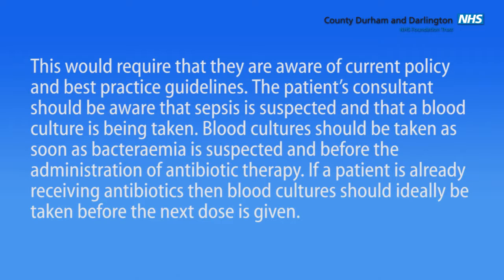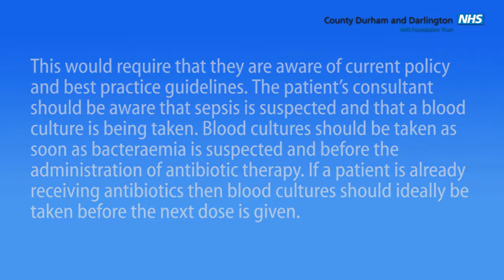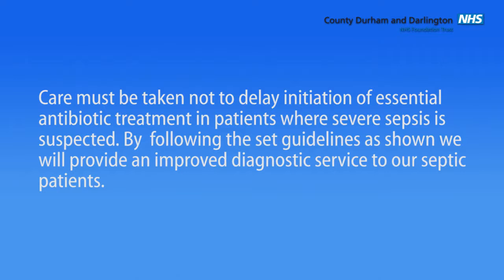The patient's consultant should be aware that sepsis is suspected and a blood culture is being taken. Blood cultures should be taken as soon as bacteremia is suspected and before the administration of antibiotic therapy. If a patient is already receiving antibiotics, then blood cultures should ideally be taken before the next dose is given. Care must be taken not to delay initiation of essential antibiotic treatment in patients where severe sepsis is suspected. By following the set guidelines as shown, we will provide an improved diagnostic service to our septic patients.